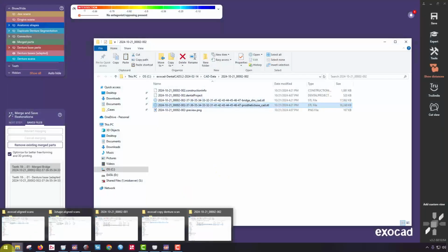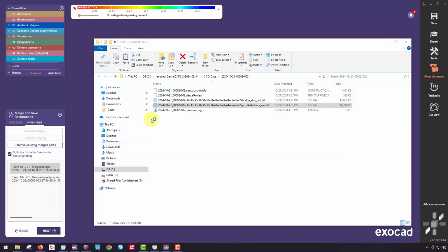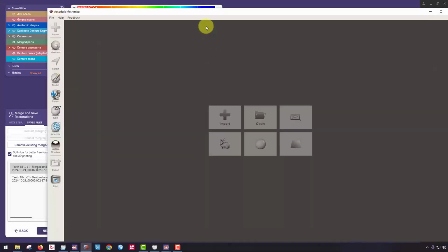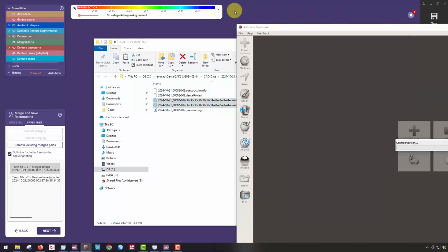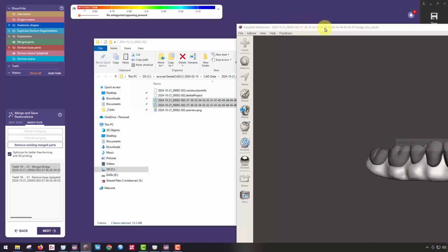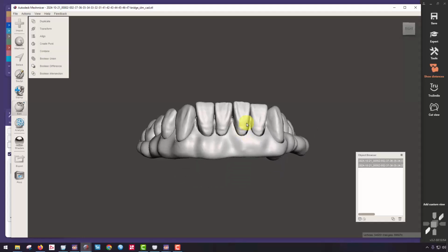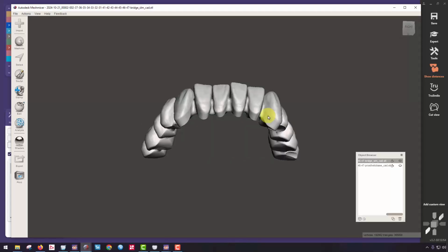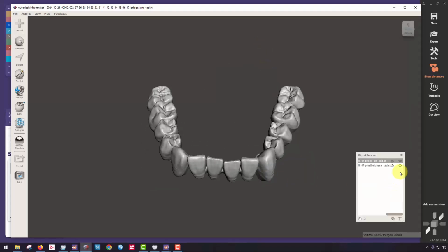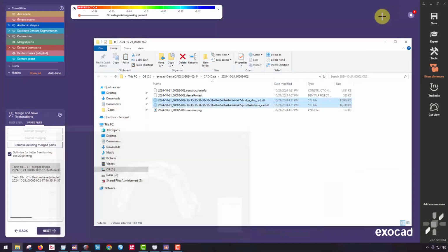Bringing those into Meshmixer. I'll bring them into Meshmixer just to go ahead and inspect them. A lot of times exocad will keep them at the proper orientation as well. So I'll just drop both of those files into Meshmixer, and we'll be able to see here probably the same orientation. There we go. Here's my two files. This one ready for printing in a tooth-colored material, and this one ready for printing in a pink base material.